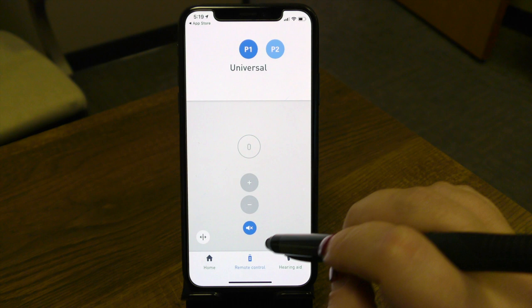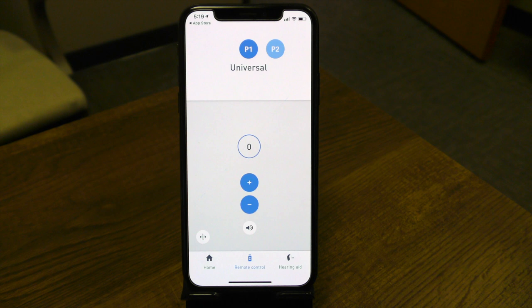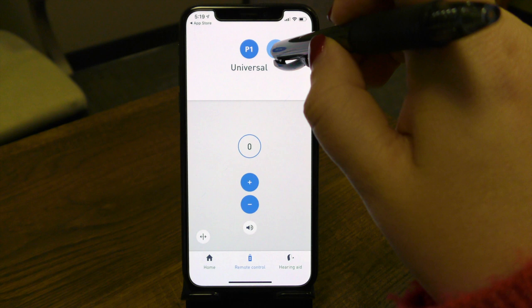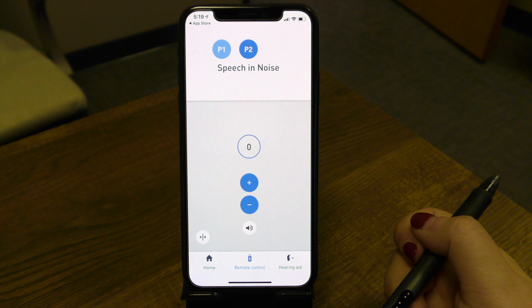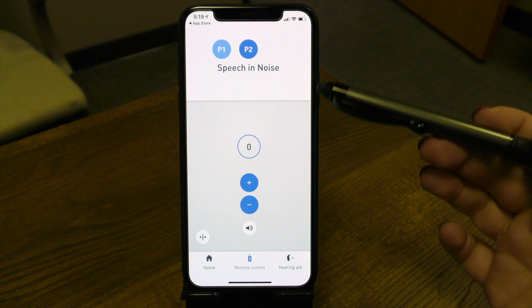Let's go ahead and unmute the hearing aid — I'll click this here. Now our microphones are back on. If you have additional programs beyond your main everyday universal program, this is how you're going to access those programs. P1 represents your first program. P2 points to the second program. In this particular hearing device, I have that set up as speech in noise — so that's for a restaurant environment, noisy places, things along those lines. Your hearing device behind the scenes is functioning differently to help maximize speech clarity in a noisy situation.